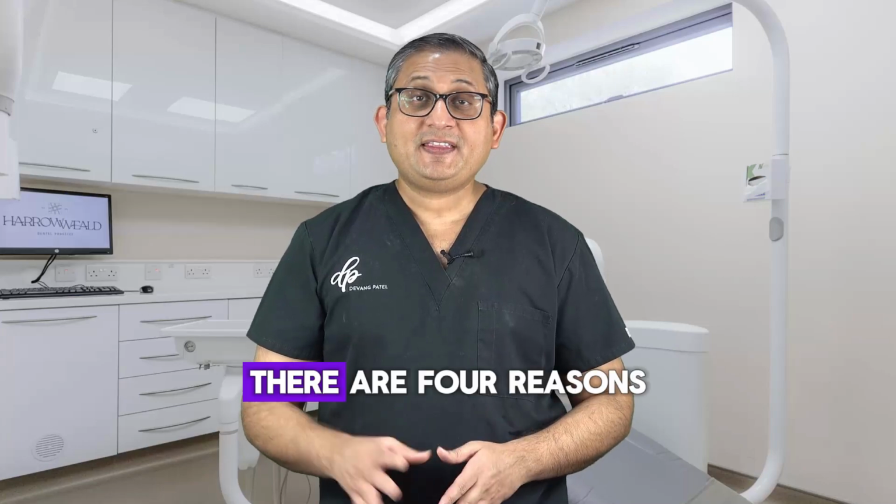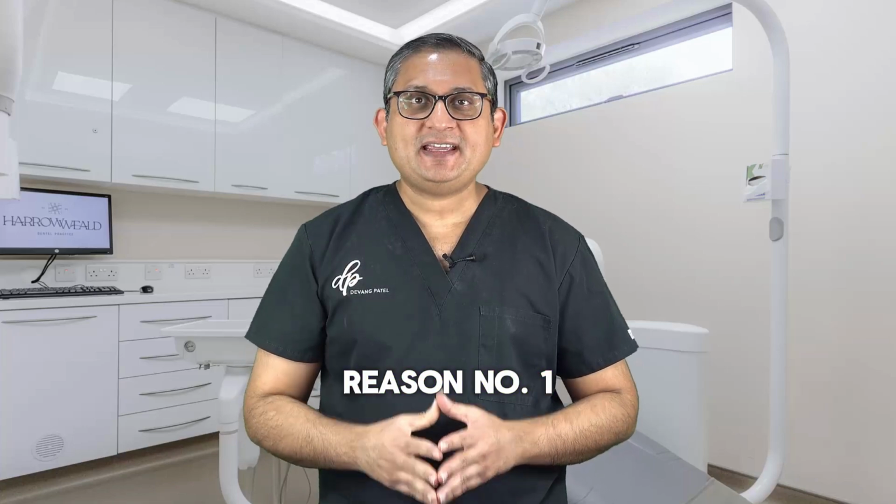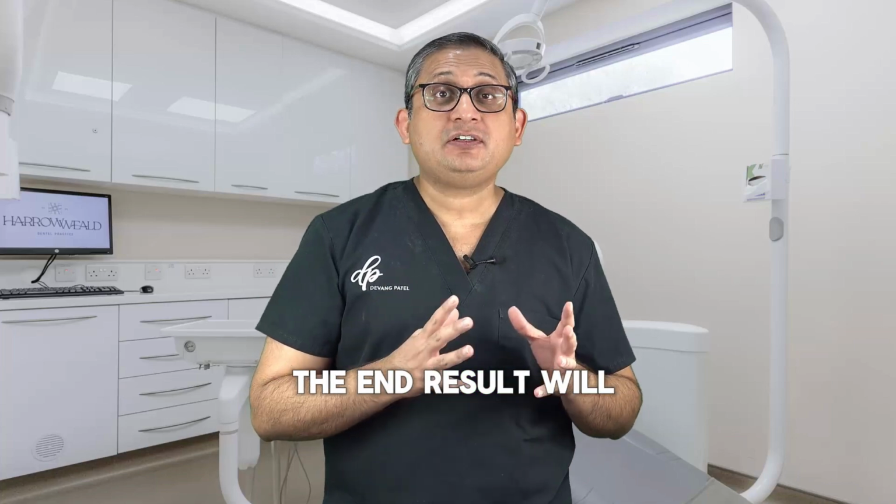Diagnostic wax-up. There are 4 reasons you should consider doing diagnostic wax-up. Reason number 1 is visualization.